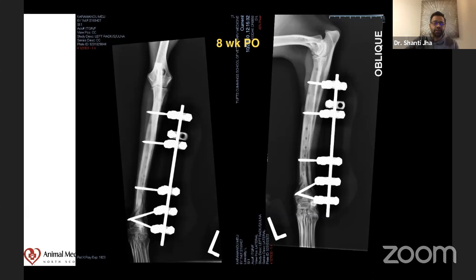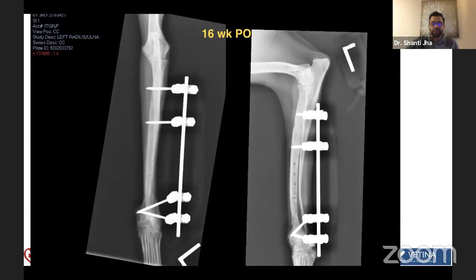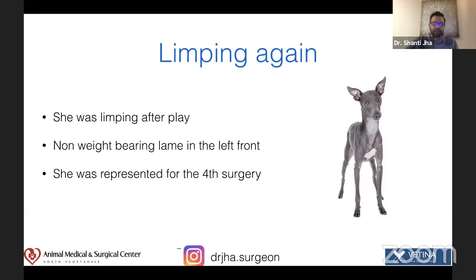This is 4 months post second revision surgery. Dog is doing this. I was very happy. The problem is the dog should not have been doing that. Dog started to limp again and presents for a fourth surgery. So this is what is happening: fracture through one of the pinholes.